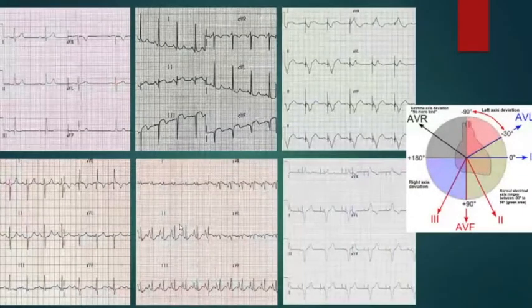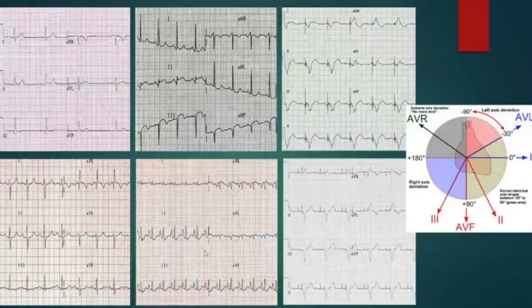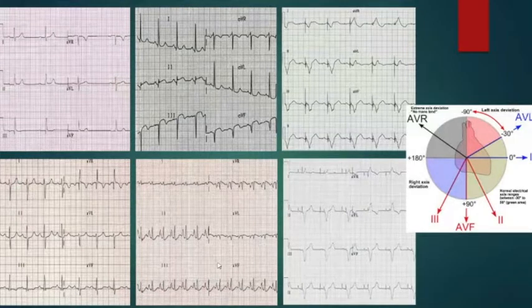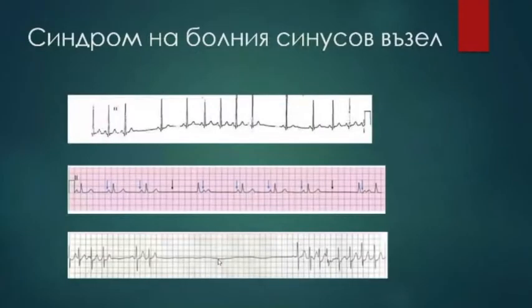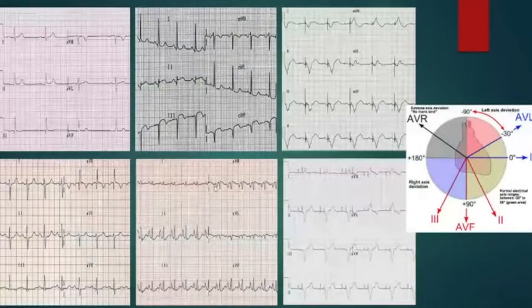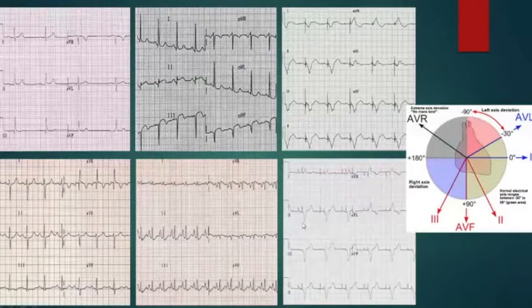Yes. In the last example, if the second lead was not equiphasic again, but it was positive instead of negative, would that mean that the axis is at -30 degrees? No. Let me check it. Sorry. I don't think in this example a second lead can ever be positive.